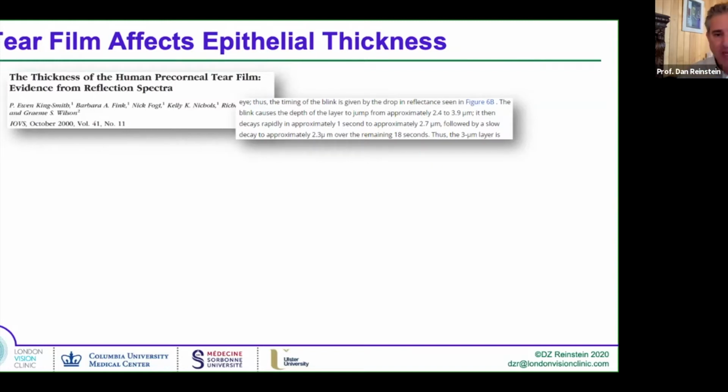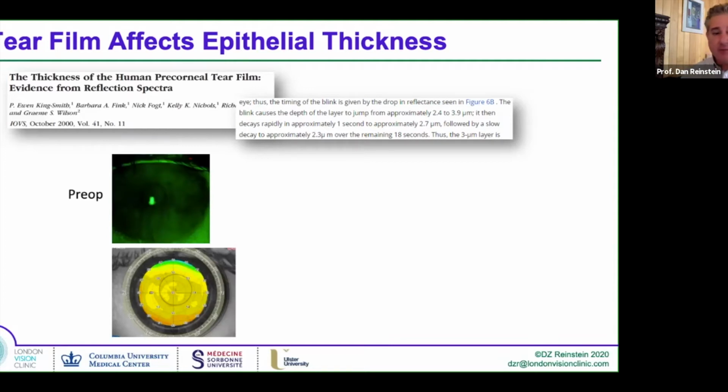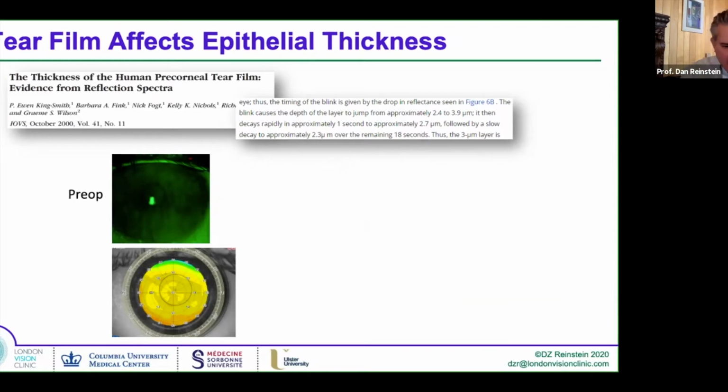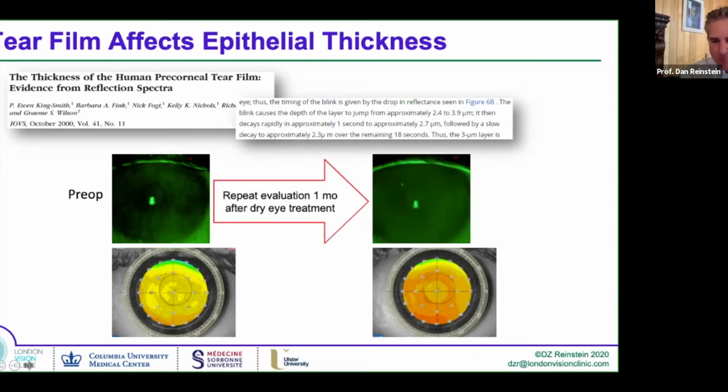And we all know that the tear film can vary tremendously. Here's a perfect example. Look at the epithelial map from my MS-39 from CSO. And this is when the patient presented for a pre-op exam. And this is a month after we instigated warm compresses in meibomian gland dysfunction measures. The tear film became much more stable, much more amenable, let's say, to having surgery. But look how the epithelial map on the same color scale completely changed. So that's because now we have a healthy, even, robust tear film. And so, you might look at this and say there's a donut shape, but actually once you fix the tear film, suddenly everything looks a lot more normal.